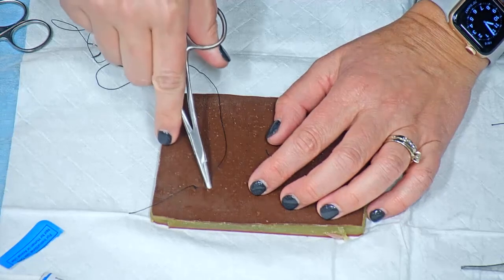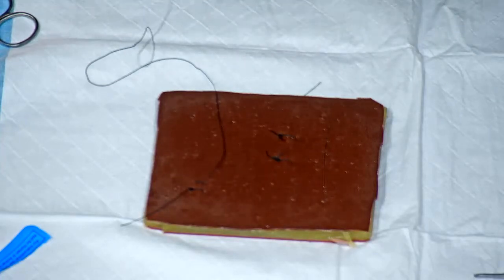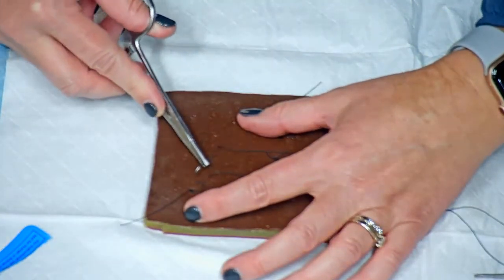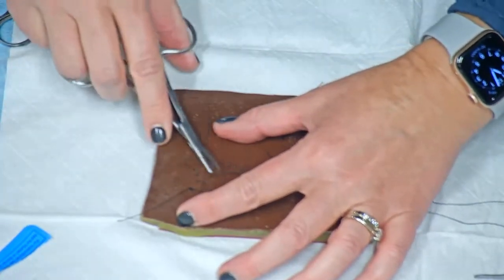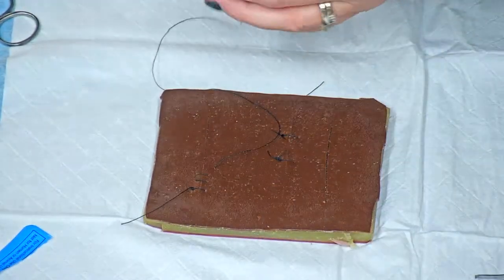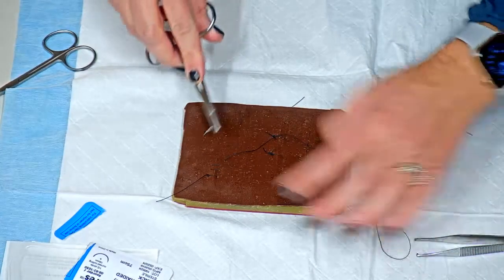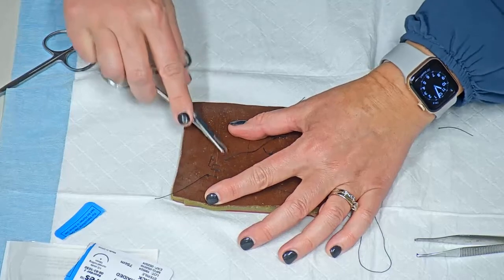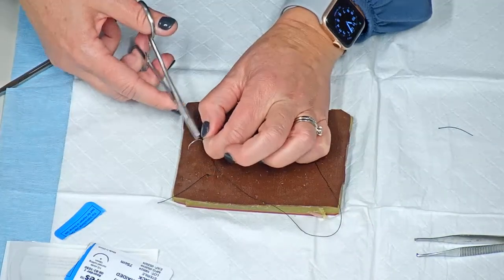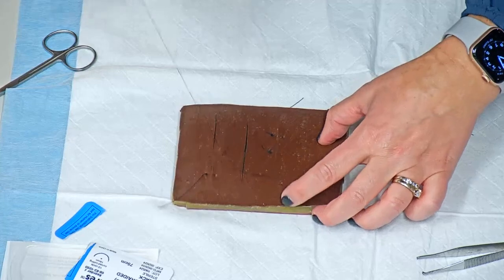And you can start to see we have these sutures marching down, kind of like train tracks down the incision. So go ahead and reload. Come in at 5 millimeters here, 45 degree down. We can keep doing that the length. Go in, and this time I'll tie it off so you can see how you would tie this off. Some of you may also notice these hemostats are a little on the old side, so that one did pop open. We'll just reload.